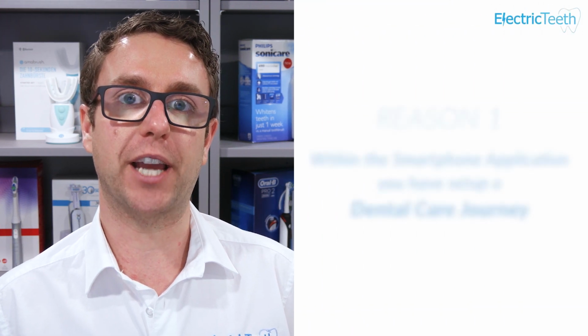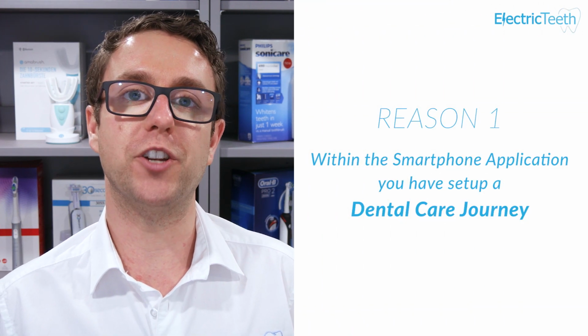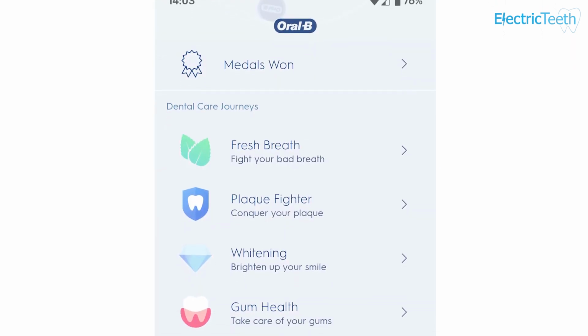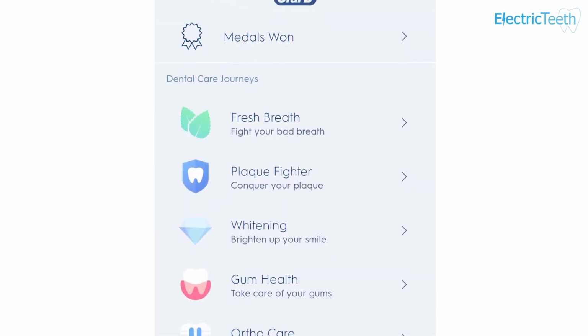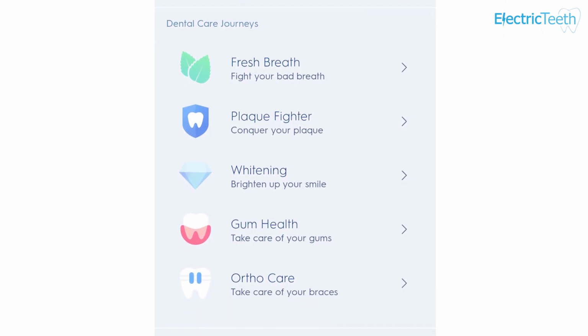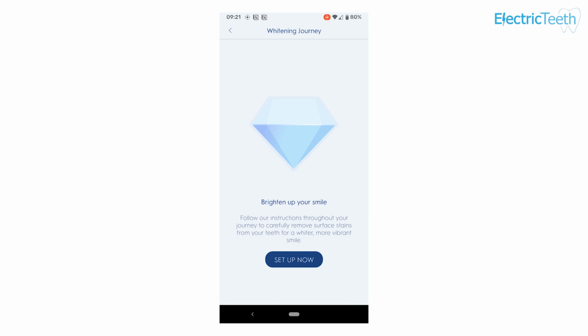The first and most common one is that within the Oral-B smartphone application, you have set up what is known as a dental care journey. Now, there are multiple different dental care journeys, but these are all geared around achieving a particular oral health care objective. It might be whitening your teeth, freshening your breath.